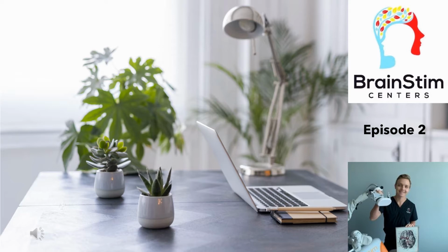TMS stands for Transcranial Magnetic Stimulation, and I think breaking down the name will be a good introduction to what the technology is and kind of how it works. So, transcranial. That's going to mean across or through your head. One thing that allows this technology to work is that it can induce changes in your brain across your skull.